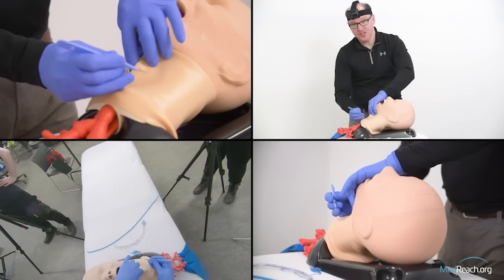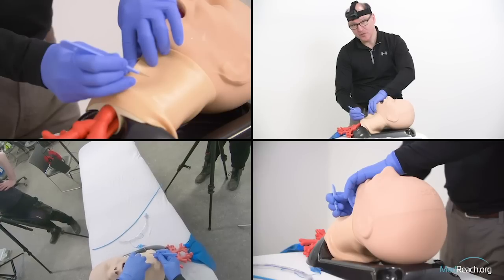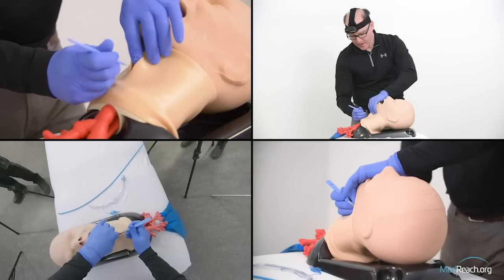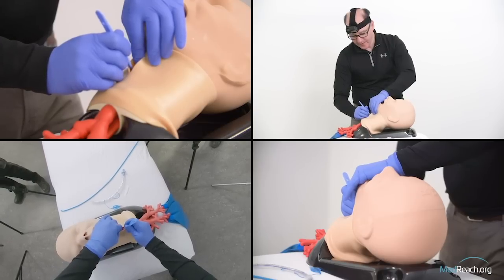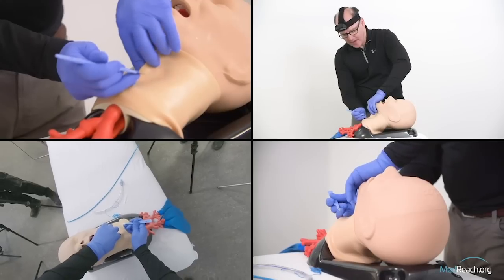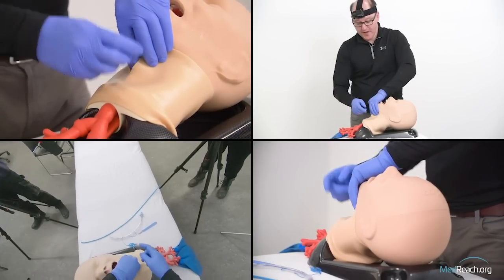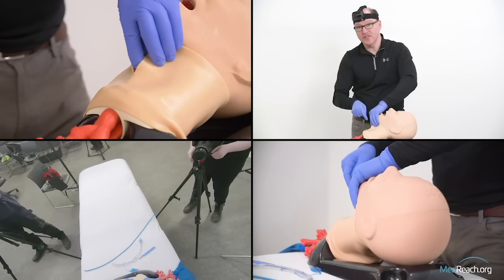The cricothyroid membrane is a little soft space between the thyroid cartilage above and the cricoid cartilage below. The trachea has a water-bottle softness descending into the sternal notch. The thyroid, if I go out laterally, is broad and flat. Once I've convinced myself where the cricothyroid membrane is, a common error is people make too small a hole and then start shoving things in that go subcutaneous instead of into the trachea.